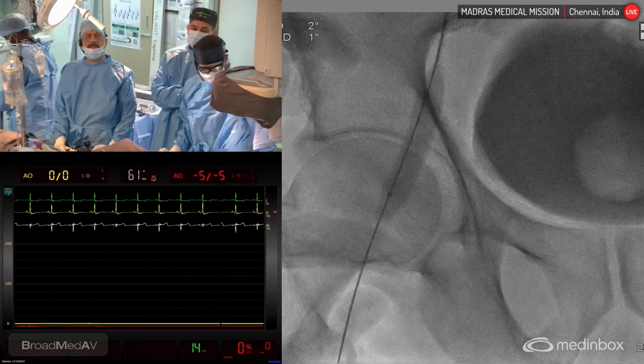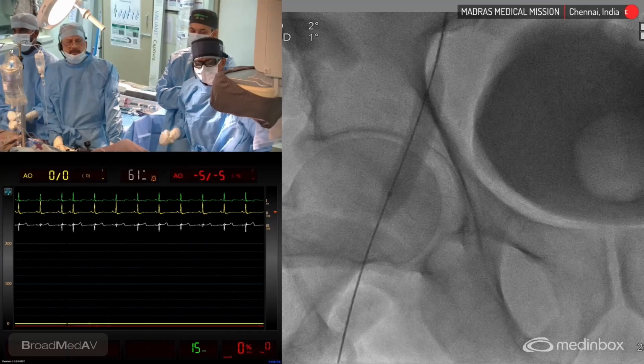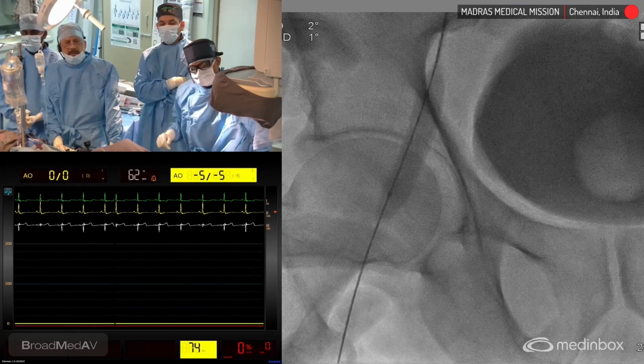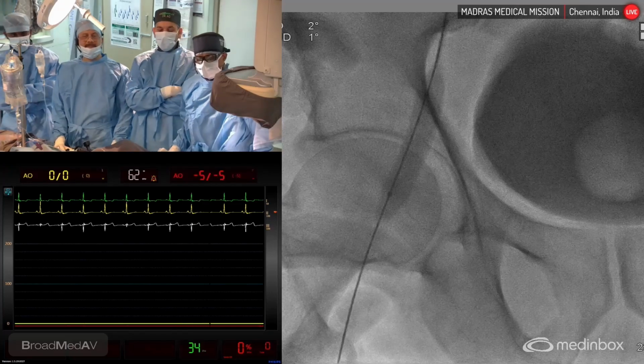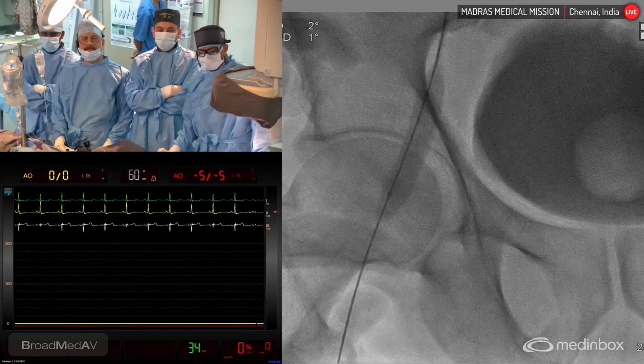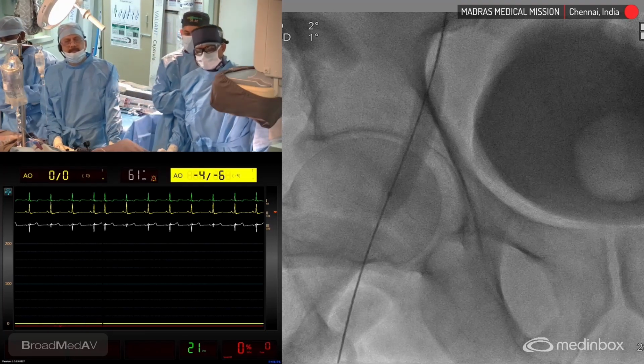Okay, who makes this stent prosthesis? I think there are different companies that make stent prosthesis. This one we are using is Medtronic, then there is Cook, Gore. There are many companies coming out with them. Is there any significant iliofemoral disease? No, in this particular case, there is no significant iliofemoral disease.